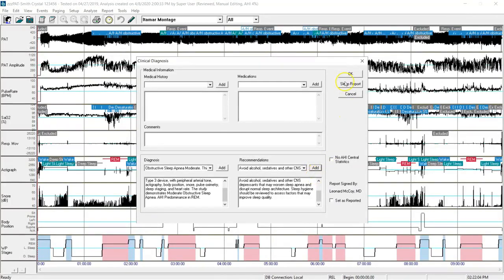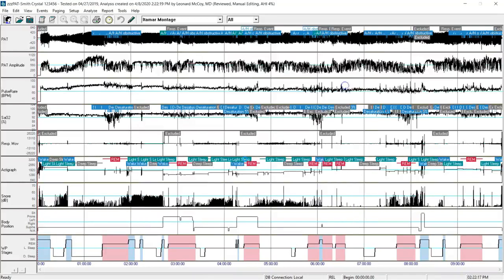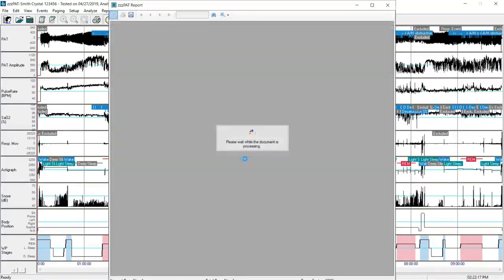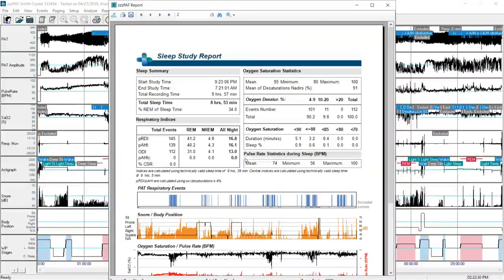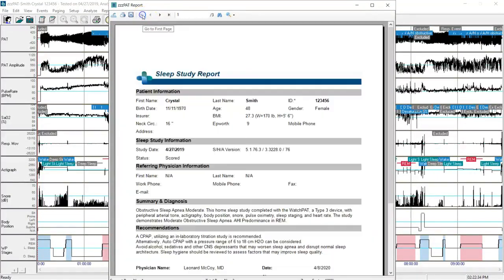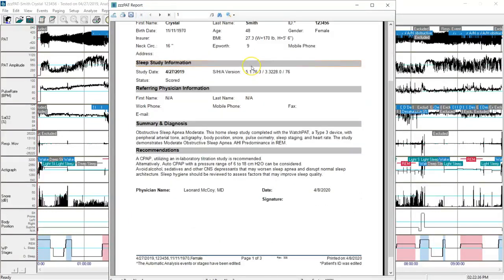I can click on the word sleep report and see what my present report will look like. Once it fully opens, I'll click the back arrow to go to the first page, and I can see my summary diagnosis as it now stands.